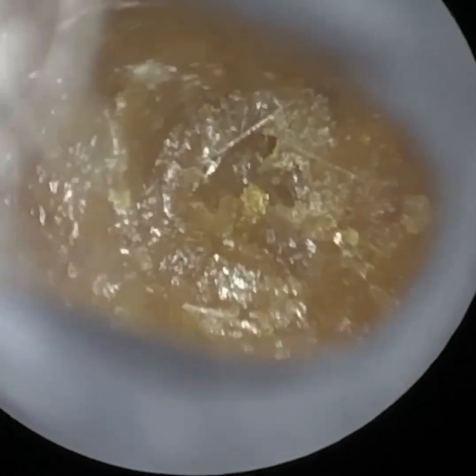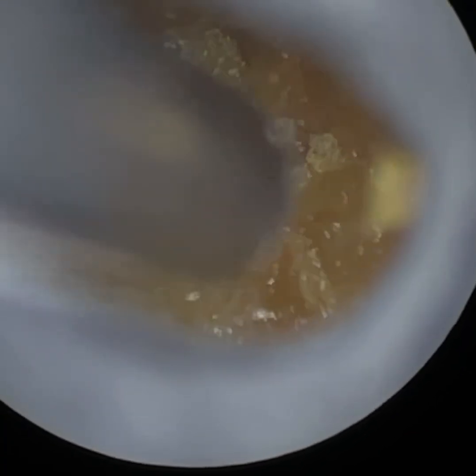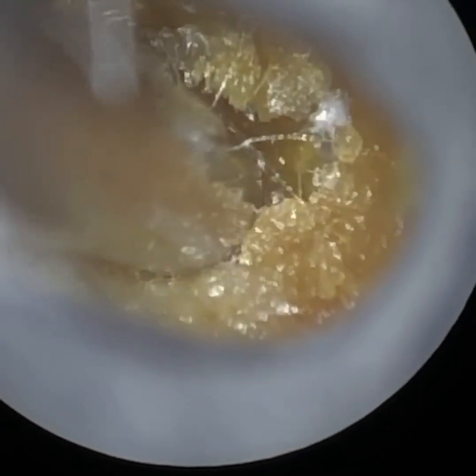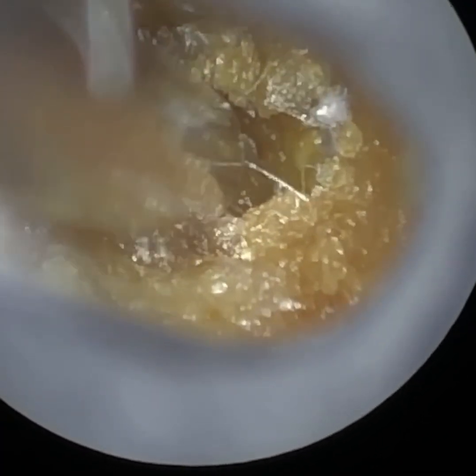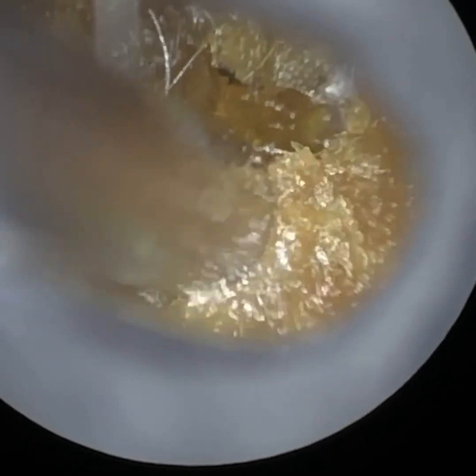I feel this video is a perfect demonstration and illustration of why I developed the Waxscope in the first instance. As you may already be aware, Clearwax developed the iClearscope endoscope back in 2015 or 2016 — it's been a few years.